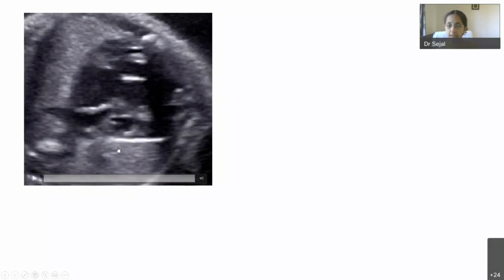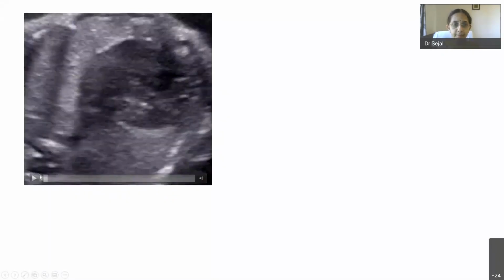Tricuspid atresia. Okay, I understand that confusion. Now let's go step by step. Let's go step by step.